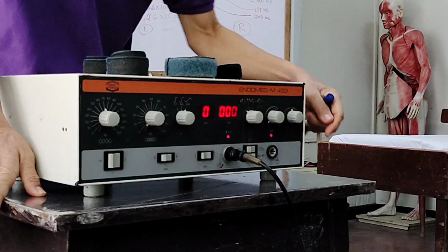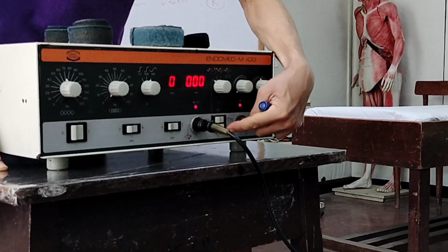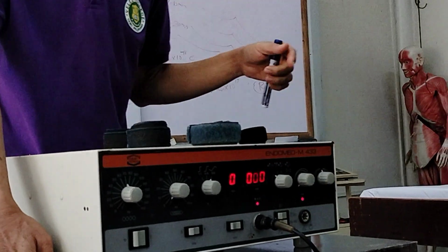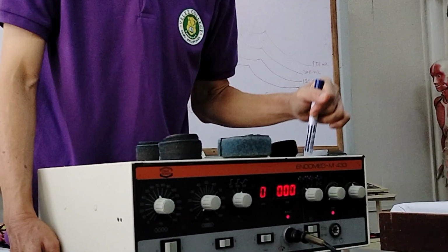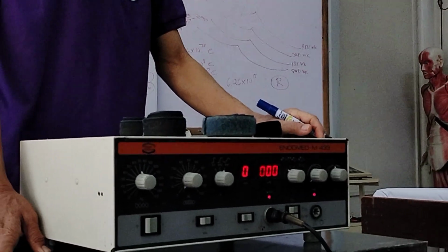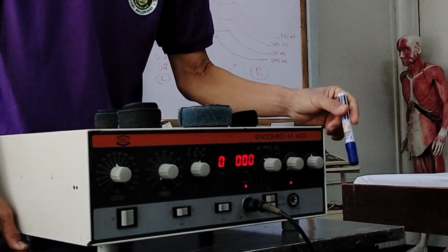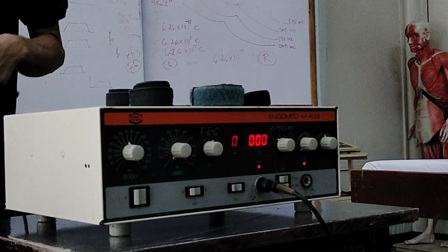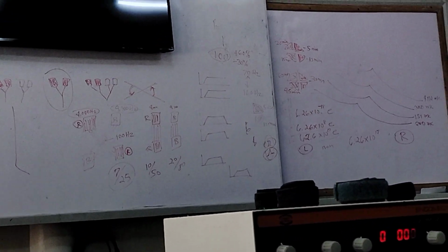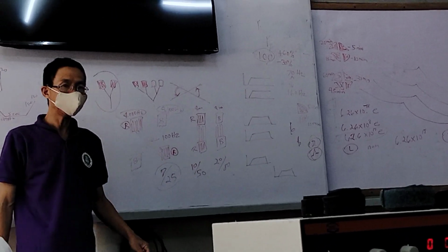Okay, further below, you have another selector switch. You have three to select from, and those are values that indicate the durations in terms of seconds, expressed as fractions. The values there are 7/25, 10/50, 20/80.